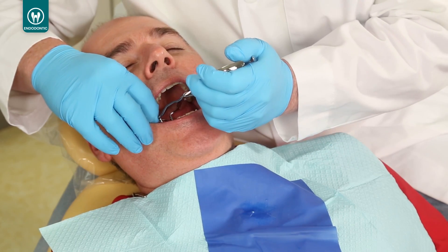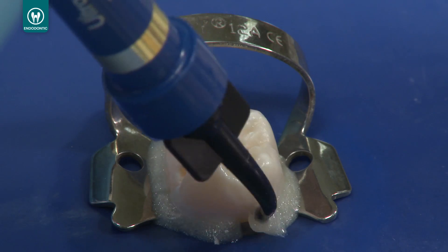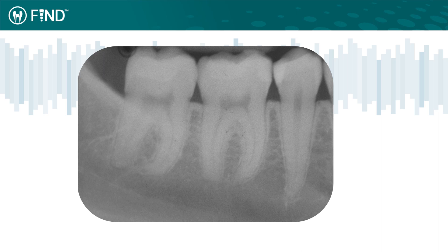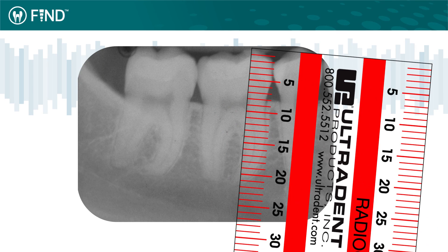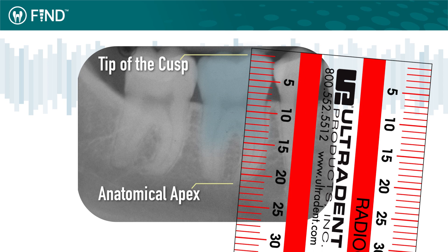To use the Find device, place a rubber dam prior to beginning endodontic treatment. Use Opal Dam or Aura Seal to prevent rubber dam leaks. Obtain an initial radiograph and measure the distance between a reference point, like the incisal edge or peak of the cusp, and the image of the anatomical apex of the canal you'll be working on. Subtract 5 mm to establish your temporary working length.